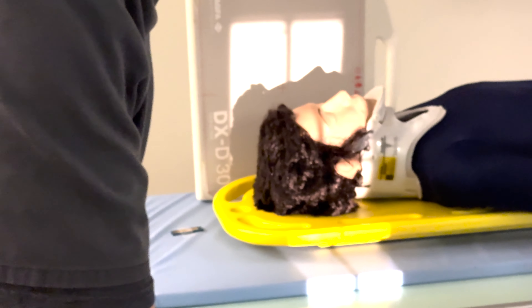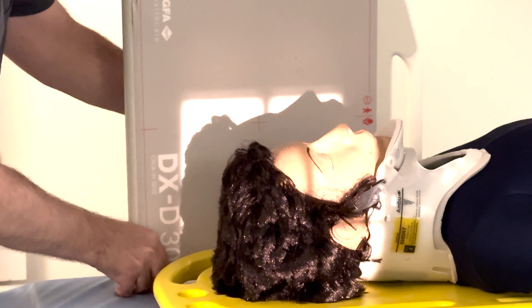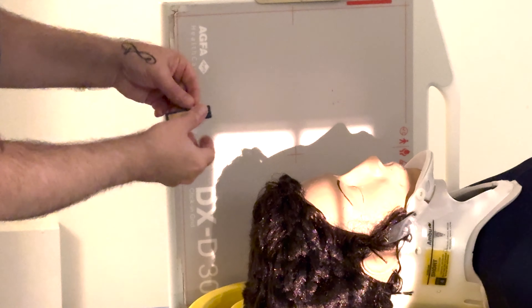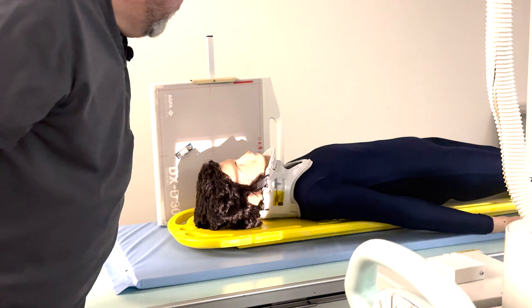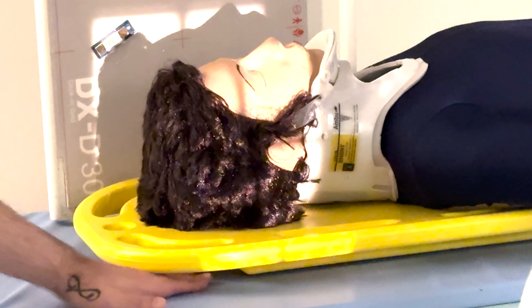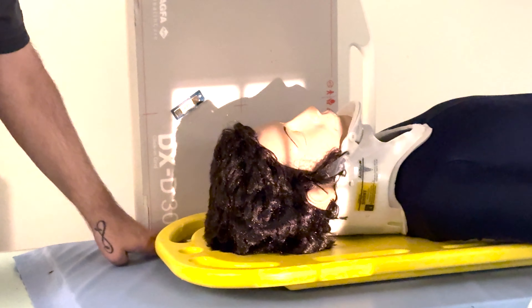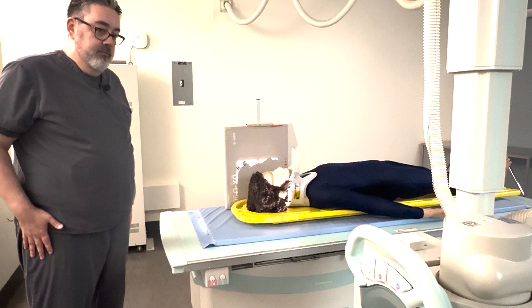I'm going to go ahead and collimate here. If you notice my crosshair on the grid is a little bit off, I can shift that just a little bit so we're right in the center and we don't experience grid cutoff. I can put my left marker anterior at the superior aspect of the patient. You need all the way from the mastoid tips up to the top — obviously you need the whole occipital bone. This backboard is actually helping to prop that up so we don't clip it on the bottom at the cassette side. You can shield still and take on suspended respiration.